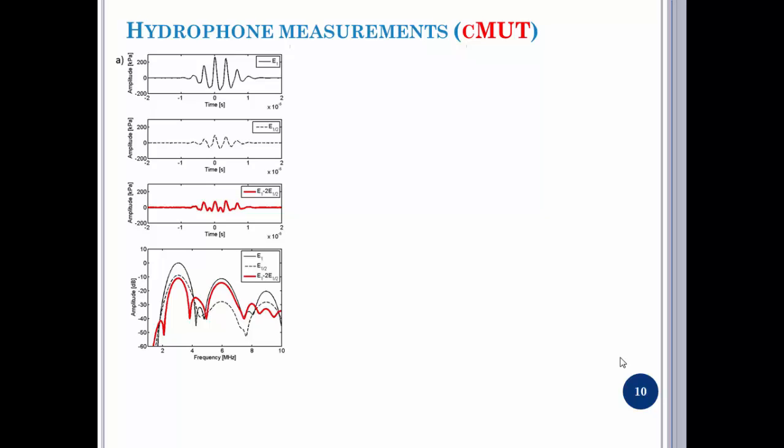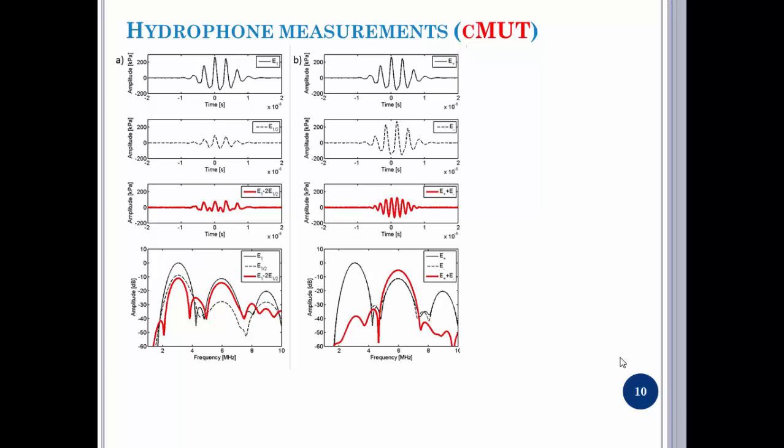When you apply it with Cmut, you can see clearly that this doesn't work. You have a remaining signal with fundamental and harmonic contents. Pulse inversion is done to cancel all the fundamental. So you have a signal at harmonics, but the reflection of this signal will give a lot of nonlinearities, and so a linear target seems to be nonlinear.